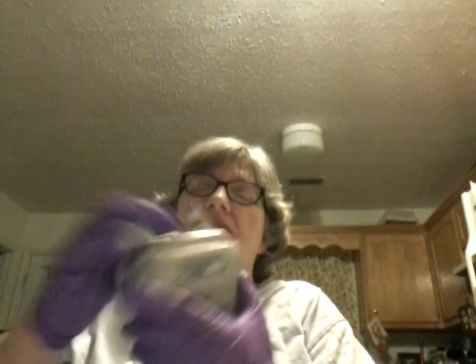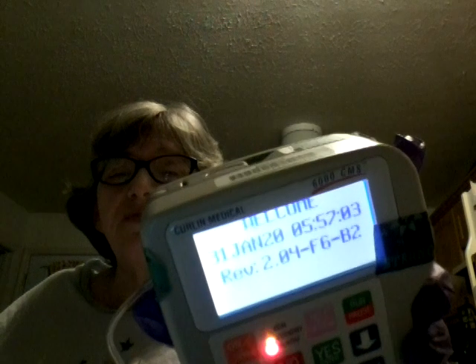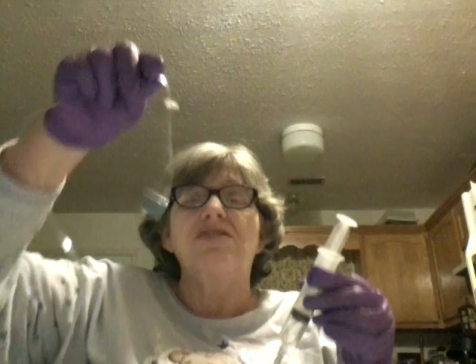It's coming out on one side and the other. I'm going to lock it down, check and make sure that the battery is full — brand spanking new battery. Self test... yep. Good battery, brand spanking fresh battery going through there. Sorry, just pulling my shirt up to see how much more I've got to do before I can plug up the rest of this stuff. So bottom line, this big line here is attached to the pump.